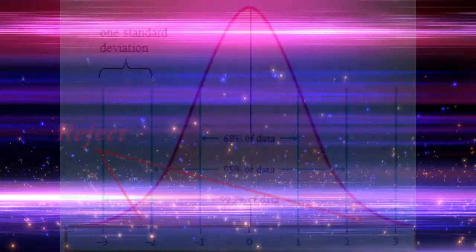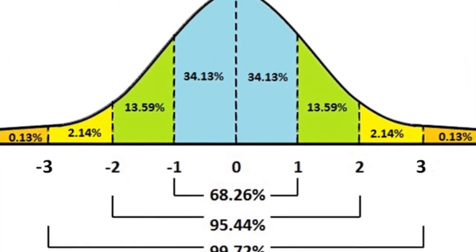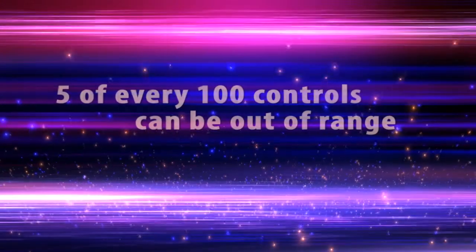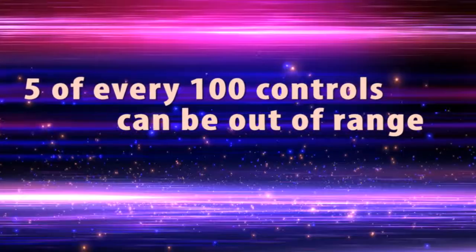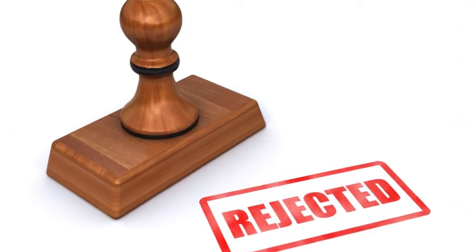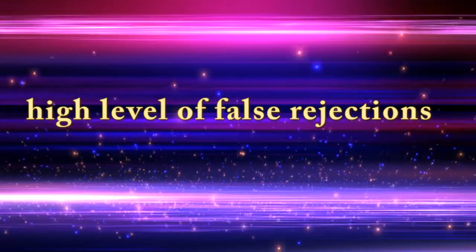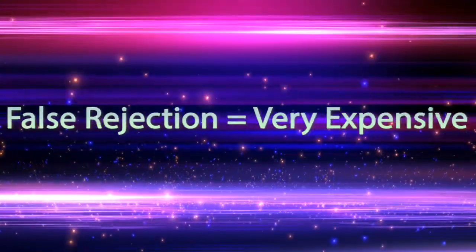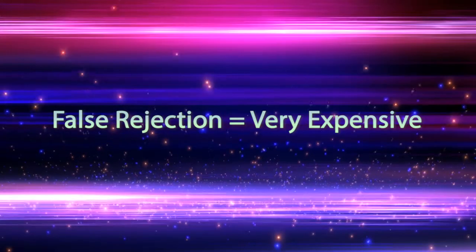With the Gaussian curve approach, any value exceeding 2 SD must be rejected. However, only 95% of values fall within the 2 SD range, meaning 5 of every 100 controls can be out of range and rejected as false rejections. This gives a high level of false rejections or false alarms, which can become very expensive for the laboratory because rejected tests have to be repeated.